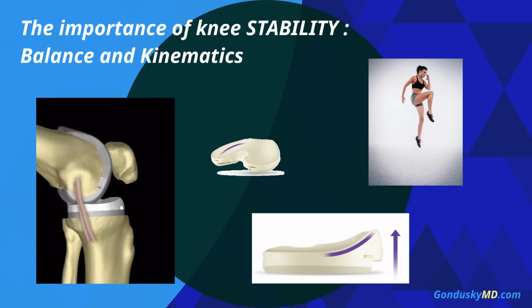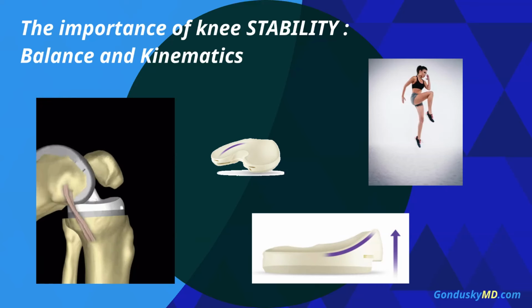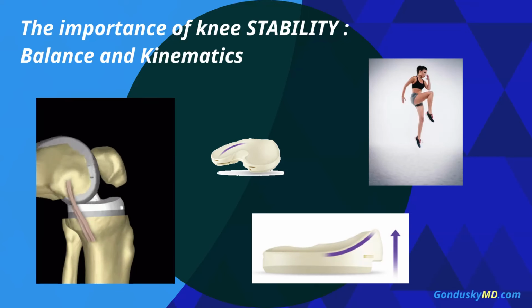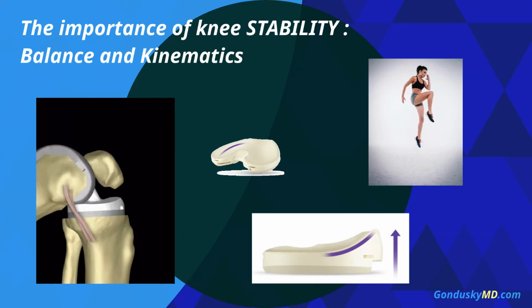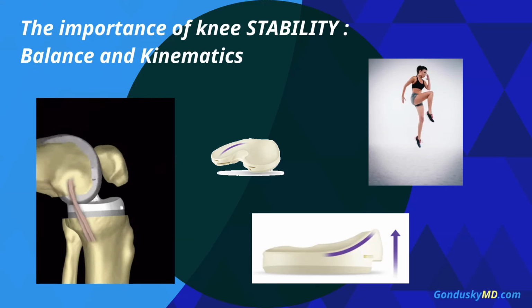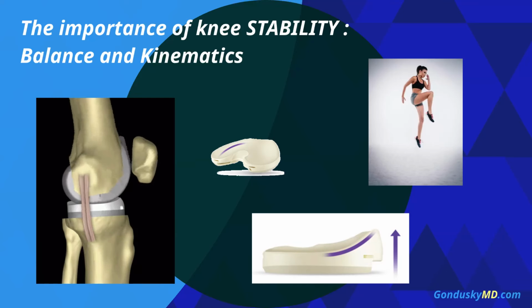So what can happen is if your knee replacement stability is not good enough for your activities, you might not like it. It might be painful and it could swell up, and therefore you won't like it with activities, or it won't function well with activities. So to combat this, we balance ligaments during the surgery, and we also use implants engineered to provide stability. Knee kinematics is one of my interests, and I have been involved in the engineering of knee replacement improvement. So, for instance, I worked on an international design team to develop a polyethylene component that aids stability between the femur and the tibia.